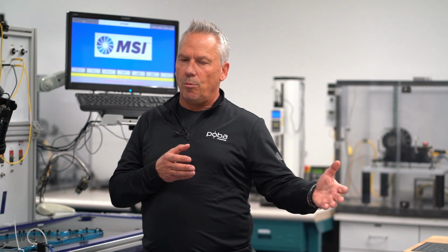Many of the modern balloons used in structural heart procedures face some of the same challenges as the original coronary applications, where stent securement or frame securement is critical to the ultimate procedure. So many techniques are now used during the early blow molding or pillow formation of the balloons to allow the balloons to securely attach the stent within certain criteria onto the balloon itself, prior to the balloon being used to deliver that stent into the specific anatomy in question.